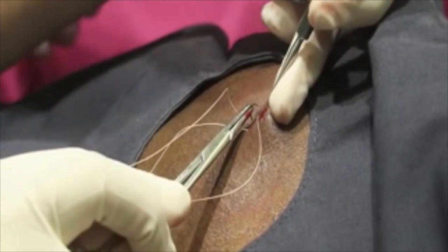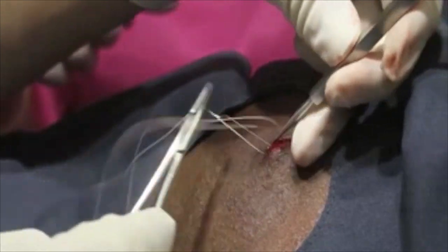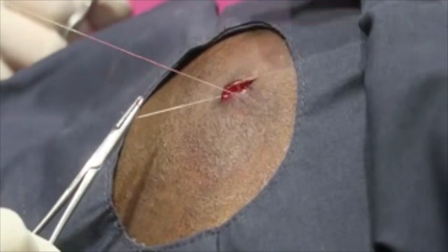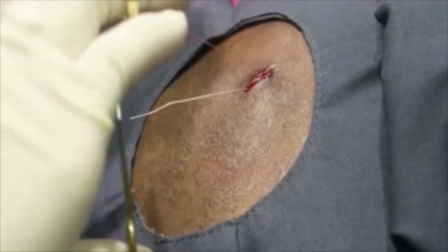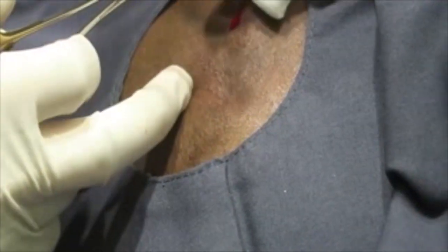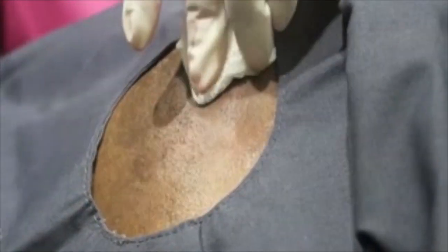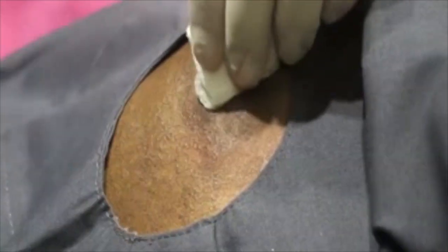So these are called buried vertical mattress sutures. These give it strength, and these get absorbed over time. But I will say, sometimes, because I know you're a little bit distant, you might not come see me for this, but you can always text me. Sometimes these spit out about 6 to 8 months later. You see like a little white whisker come out, or like a pimple. You think, am I getting a little pimple there, or is there something sticking out? It's because your body absorbs them, but sometimes it tries to spit them out at the end. So if you see that, you can give it a little pull.